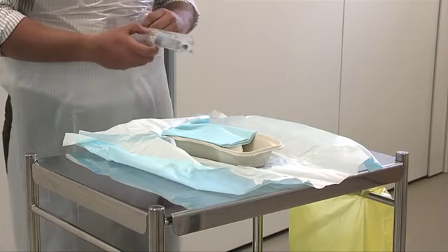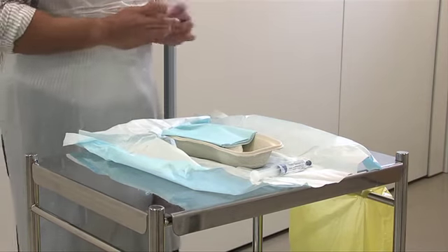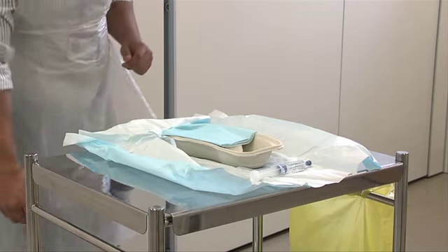Place the sterile gloves and other supplementary packs onto the sterile surface, taking care not to touch the items themselves.